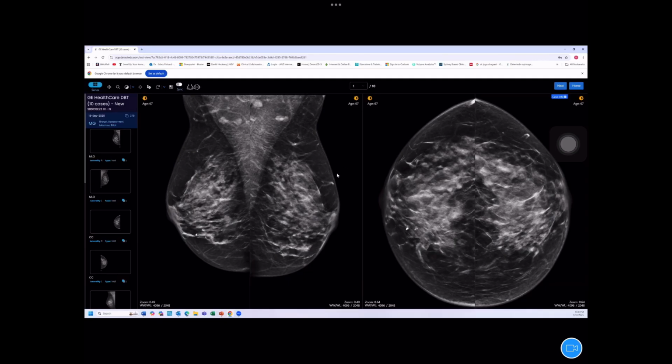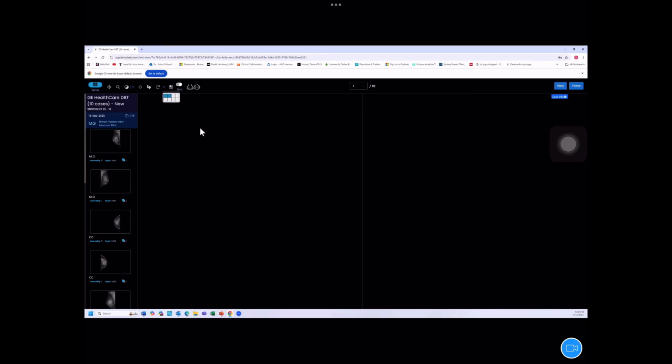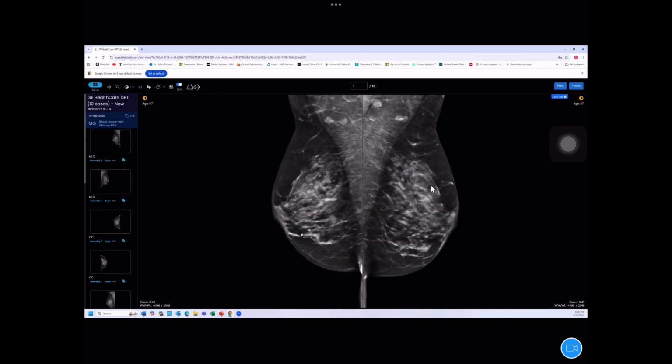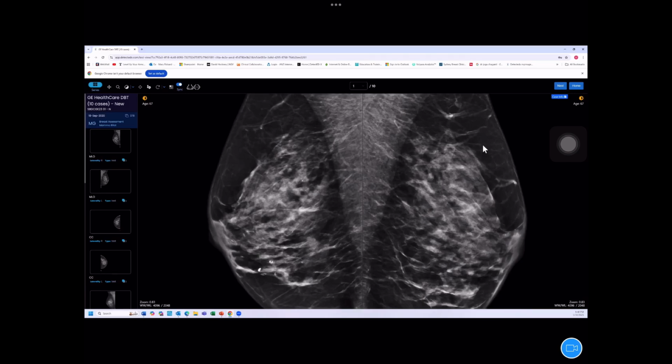Unfortunately, we don't have the time to do each one in detail, but let's just have a look at zooming up. Let's say I might put this here as 2 cases. I might display it this way as 2 images, and we'll just compare these 2. We'll sync them and we'll zoom them up, and we'll try and analyse whether we think there's anything here that is different on the 2 sides.